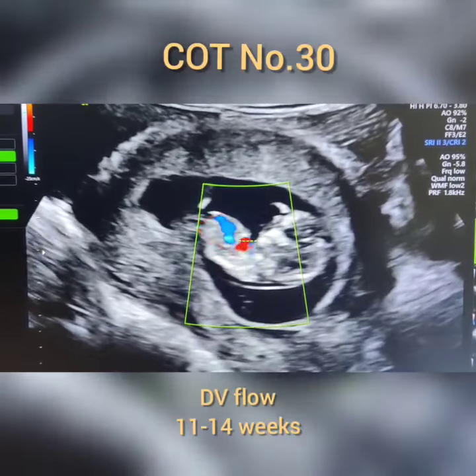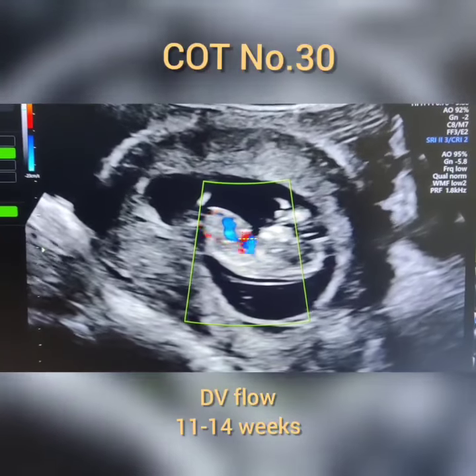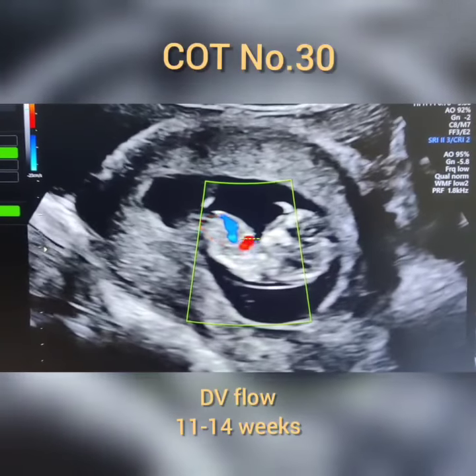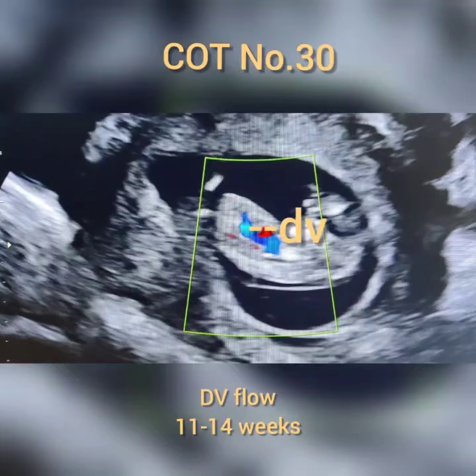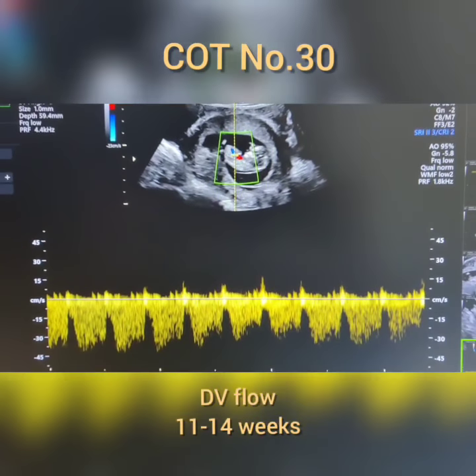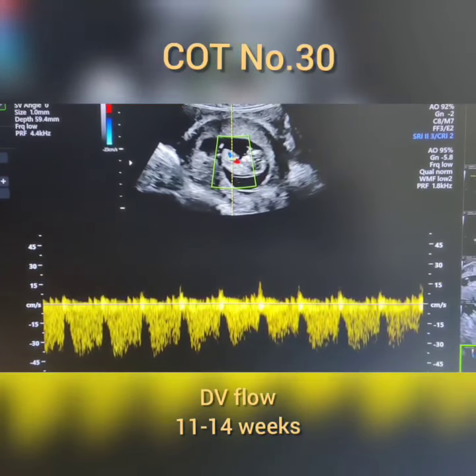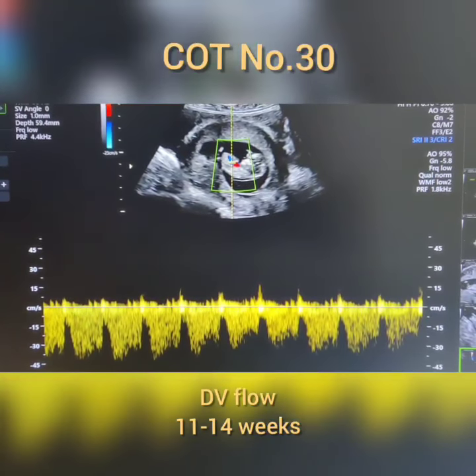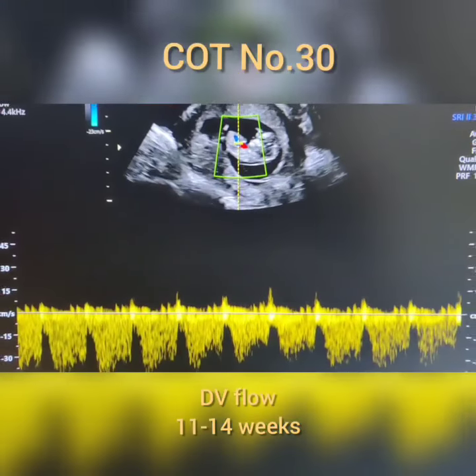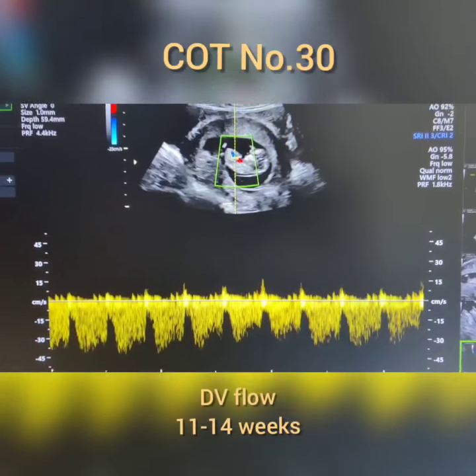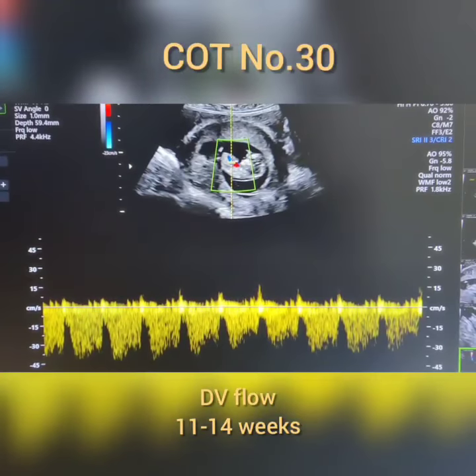Put the Doppler on that white color aliasing artifact — that's the DV flow. Apply the pulse wave Doppler and you get the DV flow pulse pattern. This is called the spectral pattern of the DV, showing the S, D, and A waves.